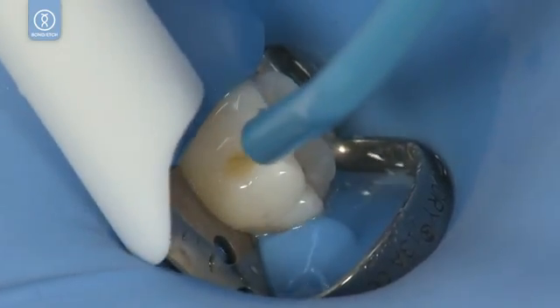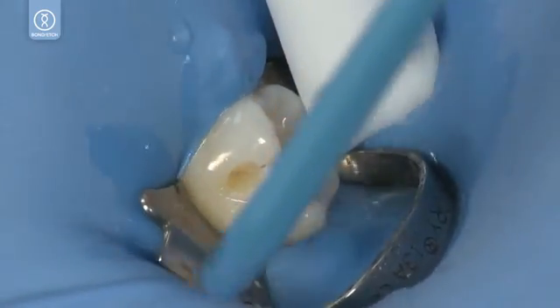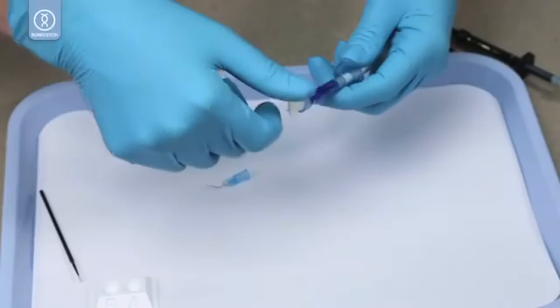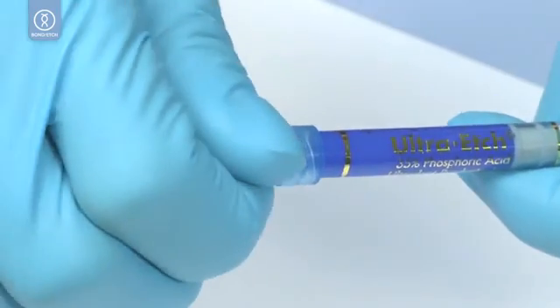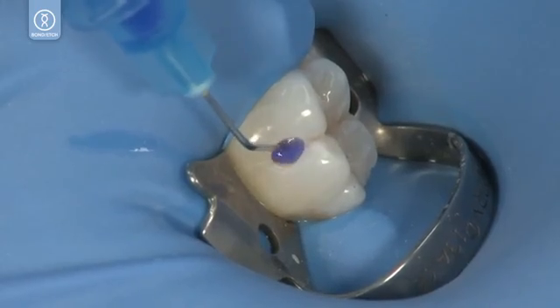Rinse and vacuum, then lightly dry. Apply Ultra Etch for 20 seconds.